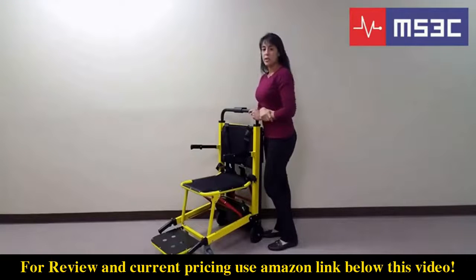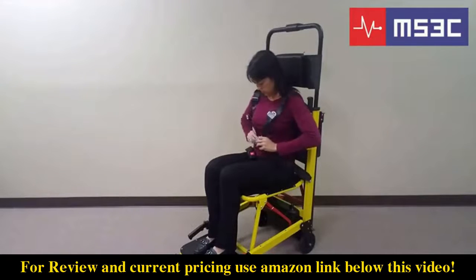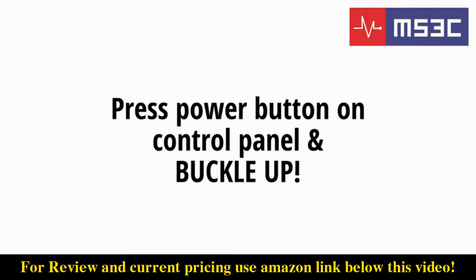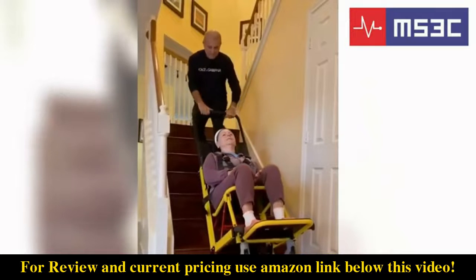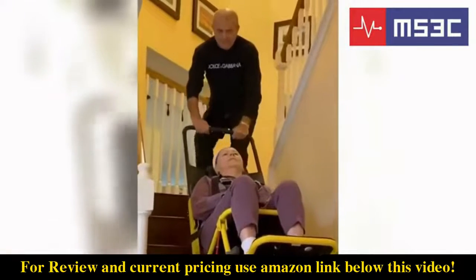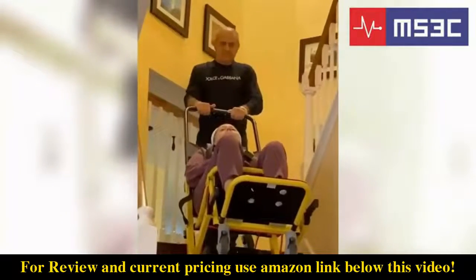Note: you do not need the key to operate the chair — it's just a safety feature. To prepare your passenger for ascending and descending flights of stairs, place them in the seat and secure the seat belts. Extend the telescoping handlebar to its outermost position. Position the chair with your passenger's back to the stairs, keeping the tracks aligned with the staircase. To ascend the stairs, tilt the chair back and press the up button. Be sure to apply downward pressure on the handle to keep the tracks engaged with the staircase. To descend the stairs, press the down button and guide the chair down the staircase.